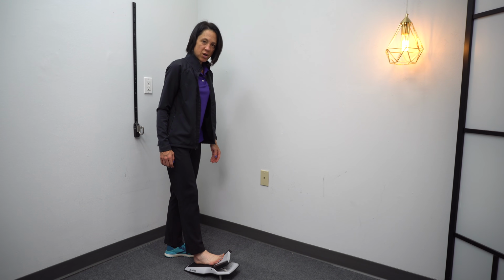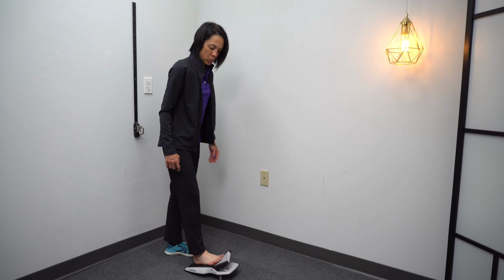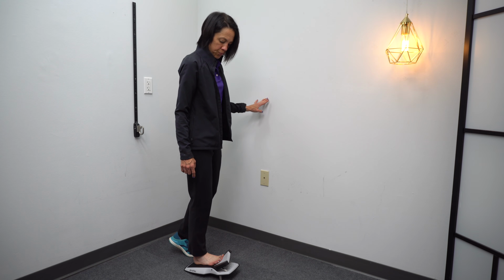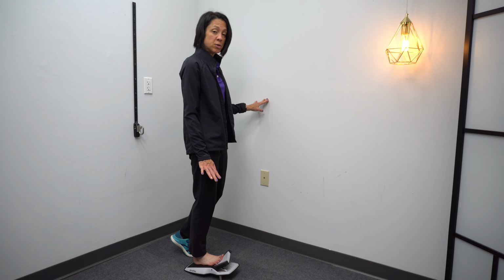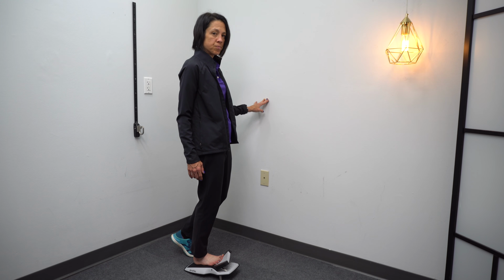All right, so now let's go ahead and go into how you use this. You just set your foot up on the incline, and then you want the bend in your ankle, like the ball of your foot, right at the bend on that board. Big toe, you want a little bit more extended, and then you want the rest of your toes in a more natural position. And then to start, you just want to lean forward. Push those hips forward a little bit, dorsiflexing that ankle.